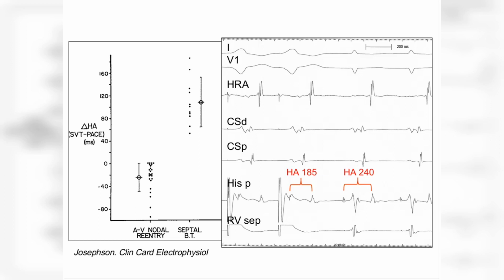Or sometimes, you know, the tachycardia appears when we are introducing the catheters, and the catheters are not in stable places already. So I think that these maneuvers have their role, absolutely, in some situations, and as you said, particularly when the activation sequence does not help.